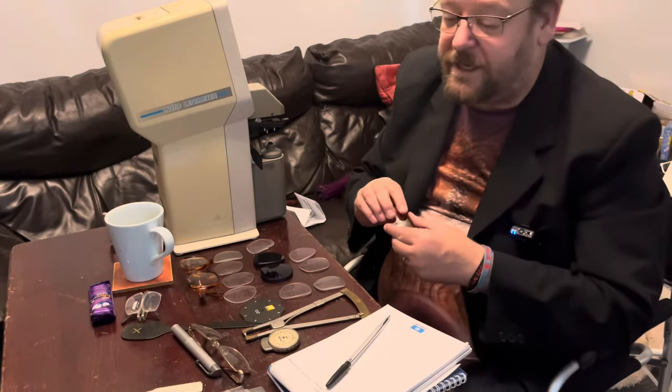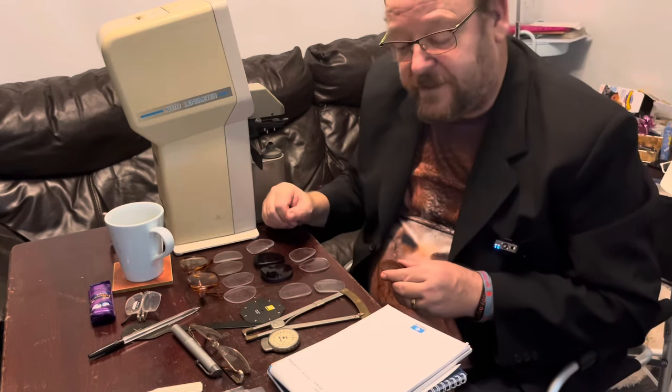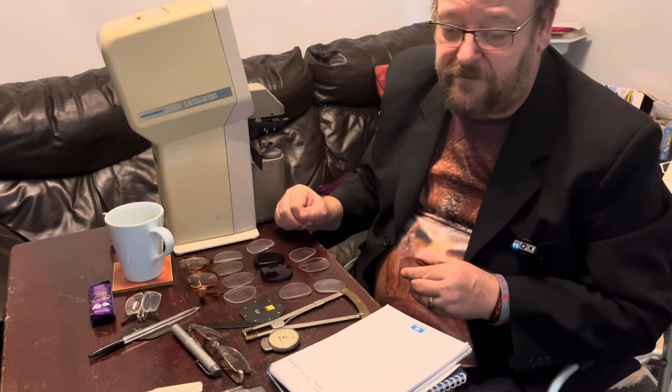Hello there. I'm going to take you through some lenses now, measuring the front surface, the back surface, and seeing if we can work out what the prescription is. Then I can compare that on the focimeter.